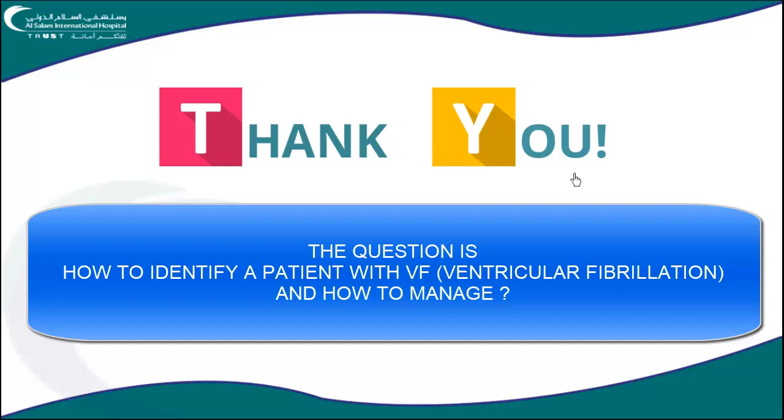So once the defib is connected to your patient, you will see a wavy line in front of you, which is called ventricular fibrillation. What you shall do is 360 joule, without giving any sedation to the patient, just put some gel on the pads, or you can attach the combo pads to your patient's chest, and then immediately defibrillate or cardiovert the patient, 360 joule. The patient will come back to sinus in most cases. You get that? So it's one type of cardiac arrest.